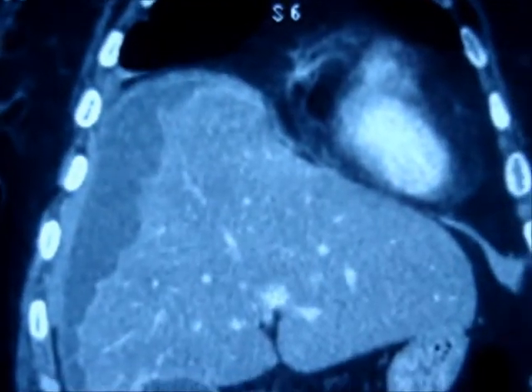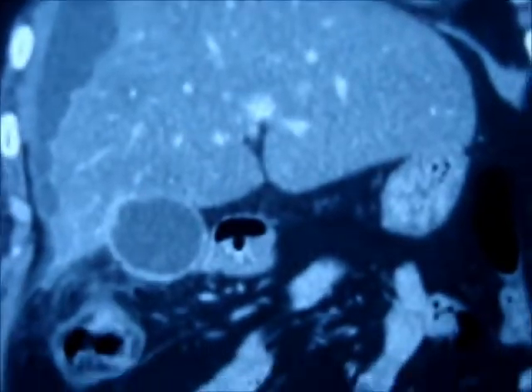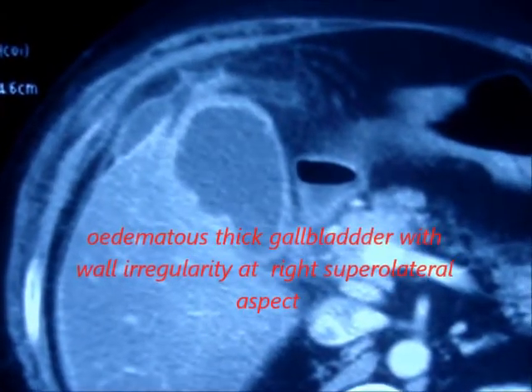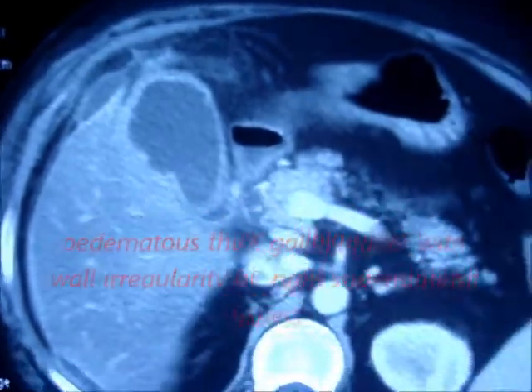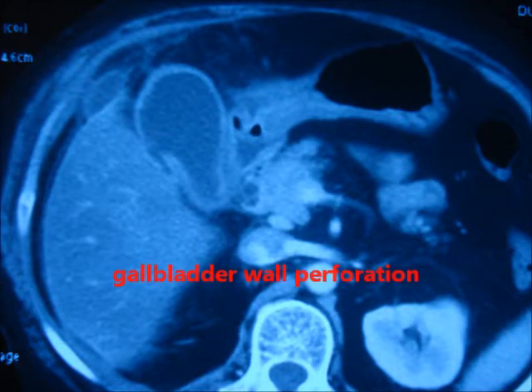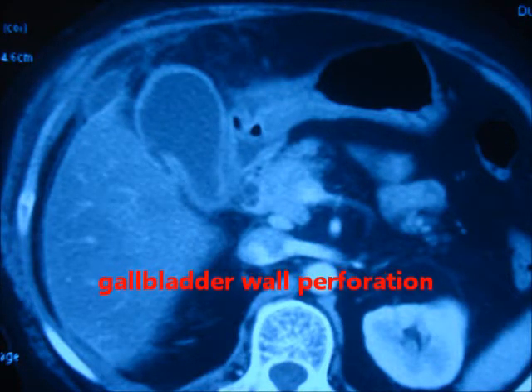There is thick mucosal enhancement with a focal defect at the superolateral aspect of the gallbladder with pericholecystic collection, suggestive of gallbladder perforation. There is a large perihepatic fluid collection with interlobe collection as well.